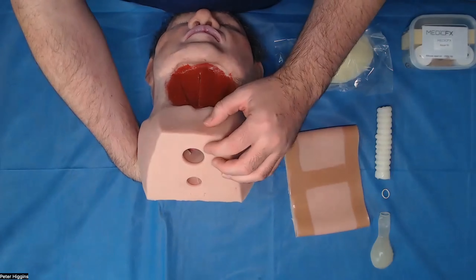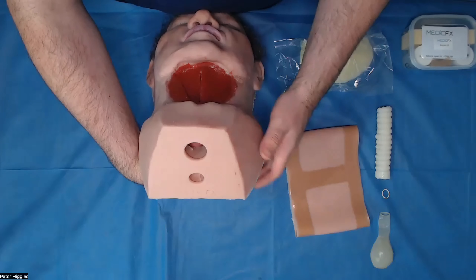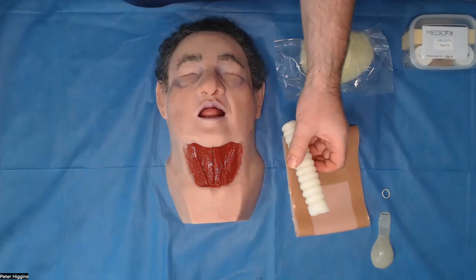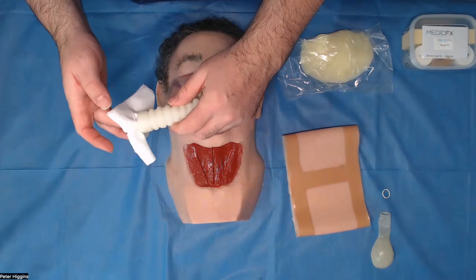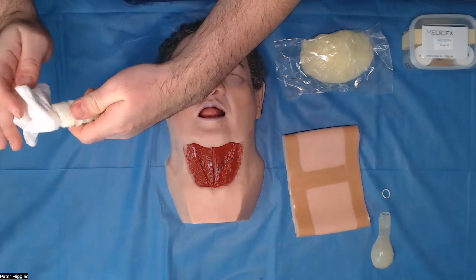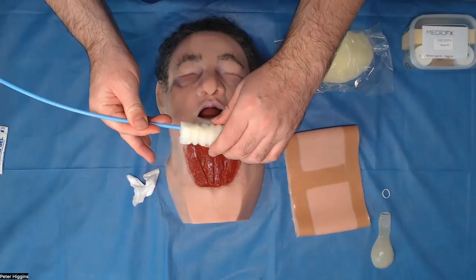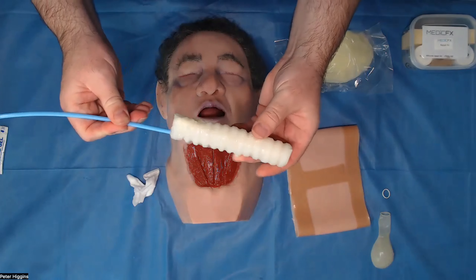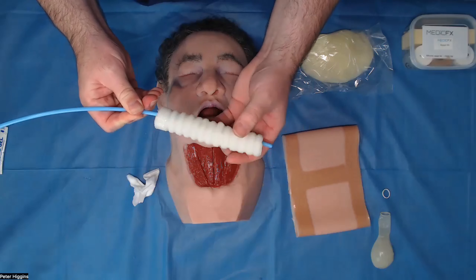So here are the exits for both the esophagus down here and the trachea up here. To insert the trachea, first of all we will need to lubricate the inside of it. Just taking a swab with some lubricant on it, just pop your finger in. If you want to be able to get the lubricant further down, just use something like a bougie or even just a pen or a stick that you have to hand, just to make sure all of the inside of this trachea is nice and lubricated.